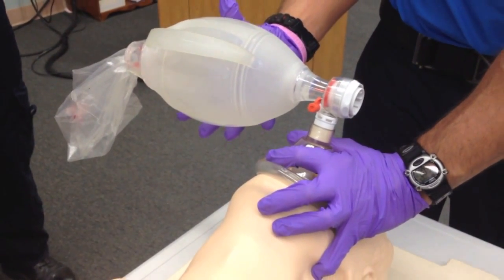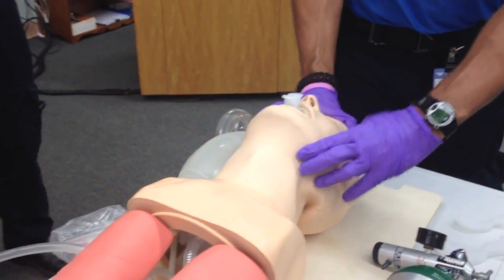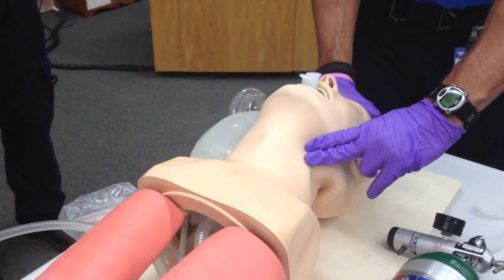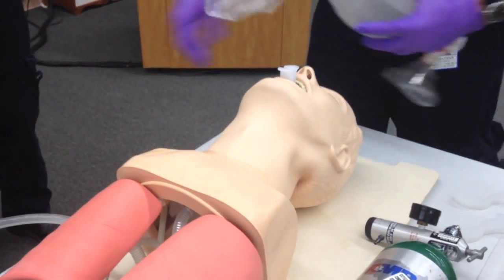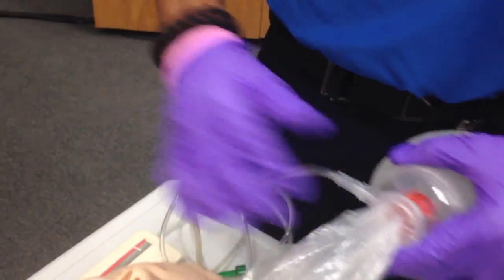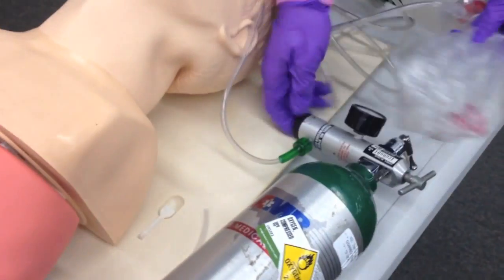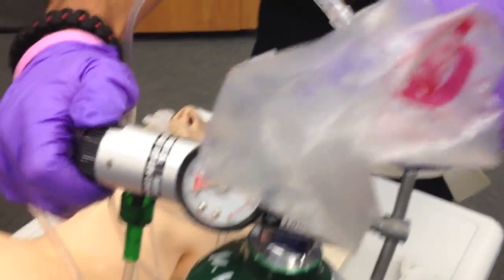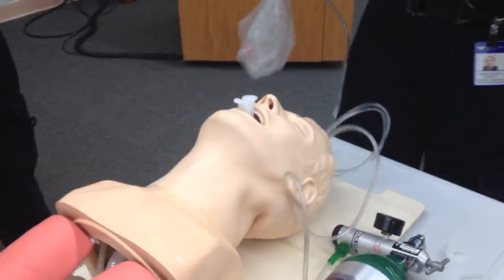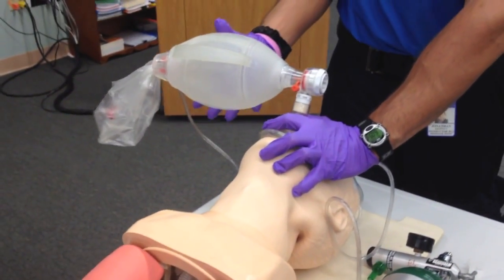Ventilations are being performed without difficulty. After about a minute, I'm going to recheck the patient's carotid pulse for five, no longer than ten seconds. The pulse is still present. I'm going to hook my BVM up to 100% oxygen, attaching the BVM to the tubing, making sure the O2 bottle is on, attaching it to the stem, and setting it to 15 liters. Reopening the patient's airway and giving ventilations again — one breath every five seconds.